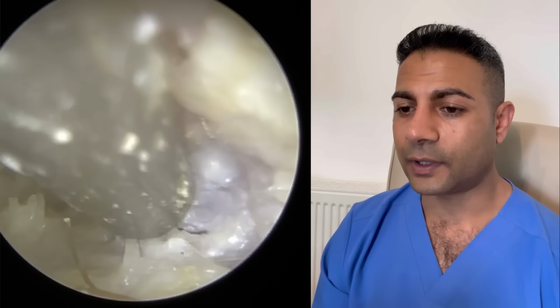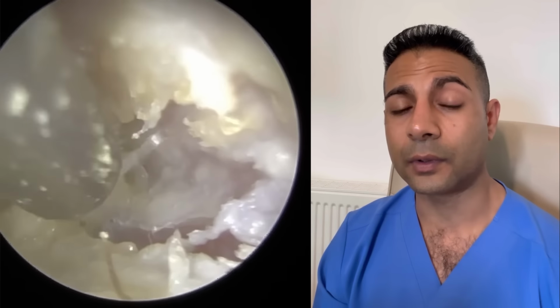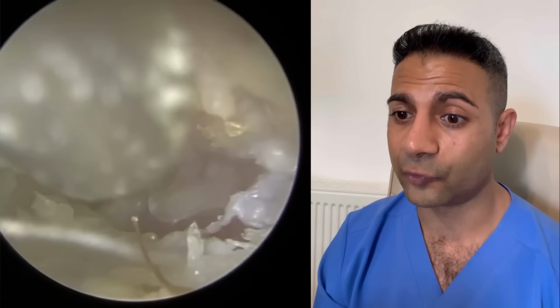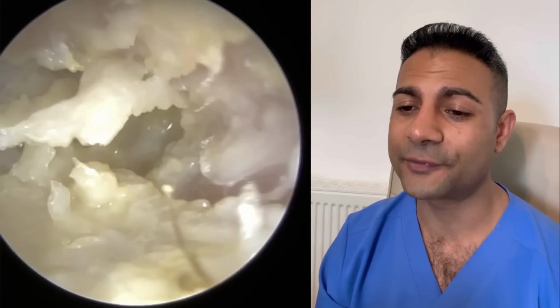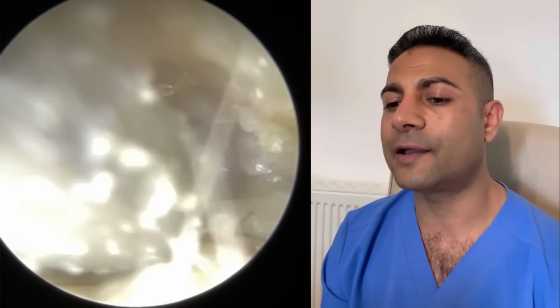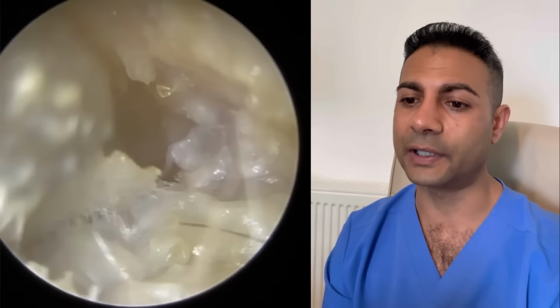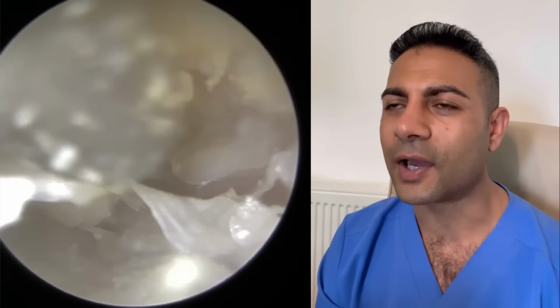Now, this patient, admittedly in the past, has used a Q-tip, what we call in the UK a cotton bud, and they have also admitted in the past to getting water in the ear, but they have reassured me on this occasion they haven't. They've listened to my previous advice and have been very careful not to poke in the ear. Now, they do have an urge, a tendency of wanting to scratch inside the ear, and that's because the ear is extremely itchy and irritable. Just by looking at this, you can understand why. But I know it's easier said than done.